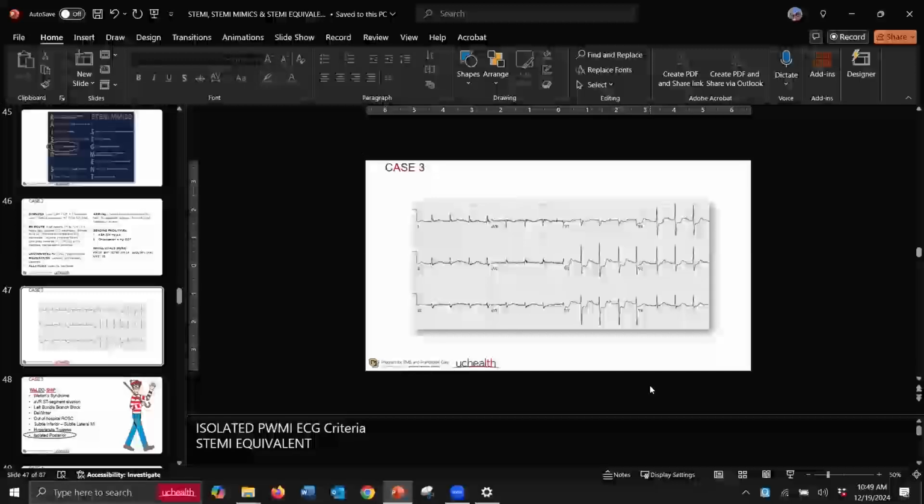Do you put the patches on? Shake your head up and down. It's okay. In my small agency, I'll go ahead and spend $99 for a set of patches on this, right? To be ready. What if you don't use them? Great. Then you don't use them. Then you don't use 'em. Do you think there's a potential of needing pressers?